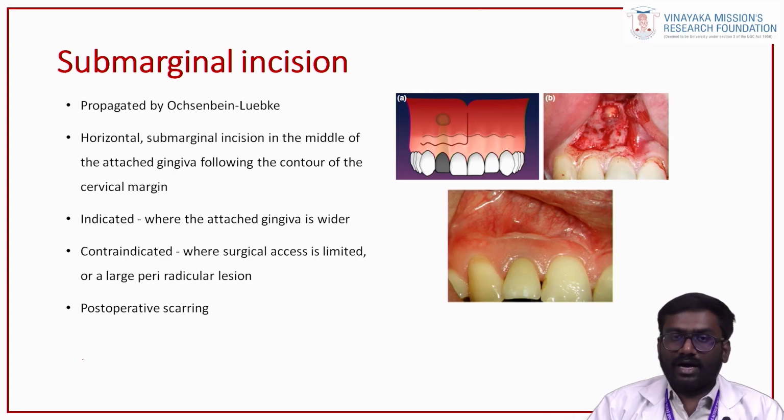It is indicated where your attached gingiva is wider in the region, so that reapproximation can be easy. If your attached gingiva is very narrow, this technique cannot be used. It is contraindicated where the surgical access is limited or a large periradicular lesion is present. Postoperative scarring is again a problem.